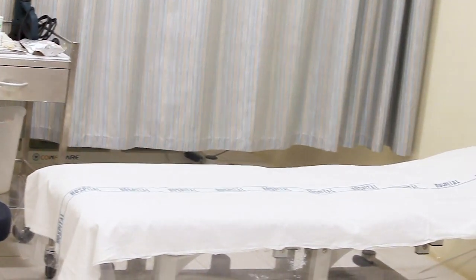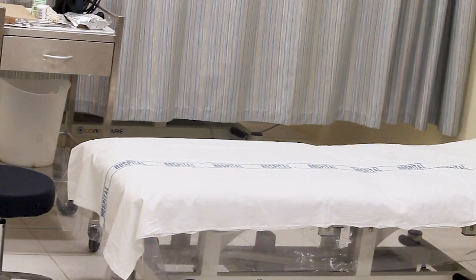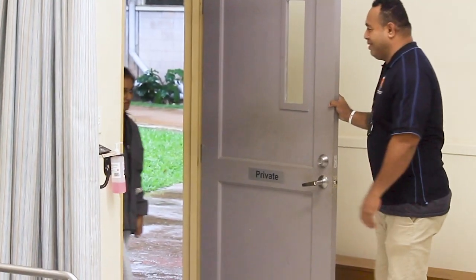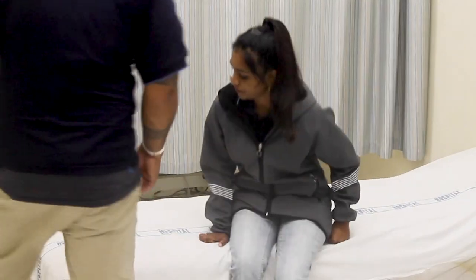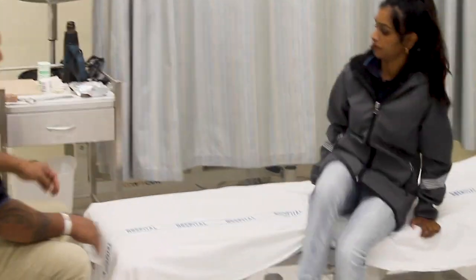Make sure the workspace is clean, well laid out and ready for appropriate treatment flow. Explain the process you will be carrying out to the person and how a total contact cast shoe will help them. Encourage the person to ask any questions.